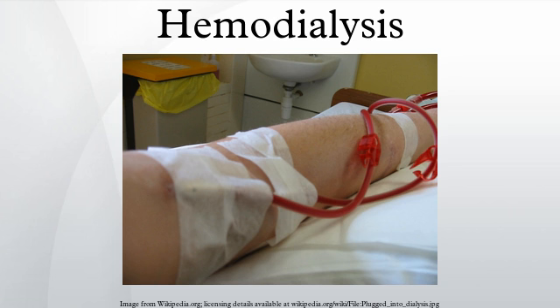The original Kolff kidney was not very useful clinically, because it did not allow for removal of excess fluid. Swedish professor Nils Alwall encased a modified version of this kidney inside a stainless steel canister, to which a negative pressure could be applied, in this way effecting the first truly practical application of hemodialysis, which was done in 1946 at the University of Lund.